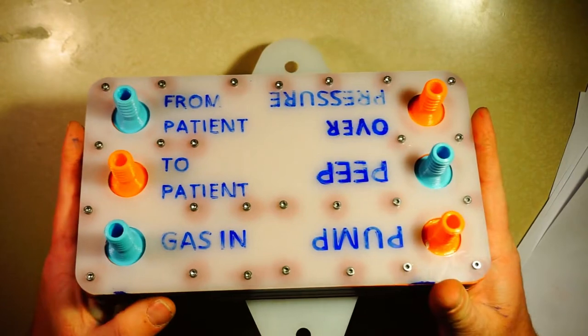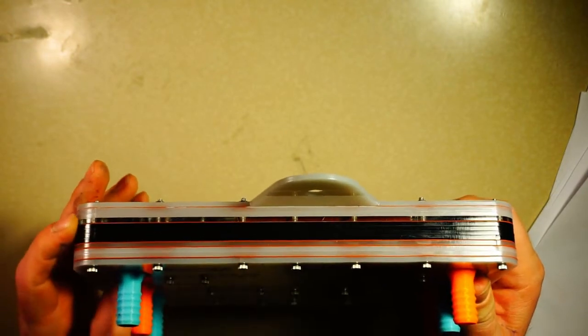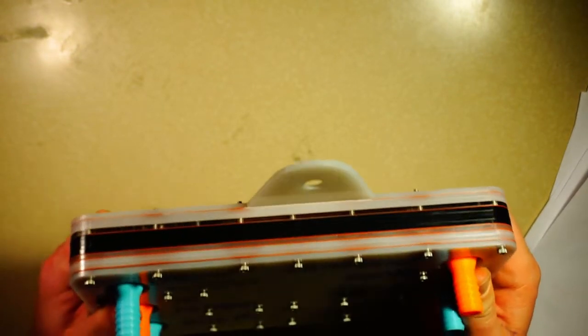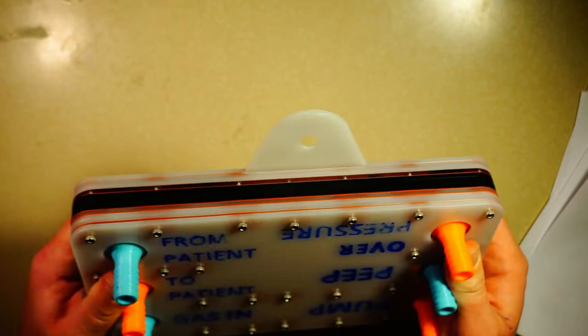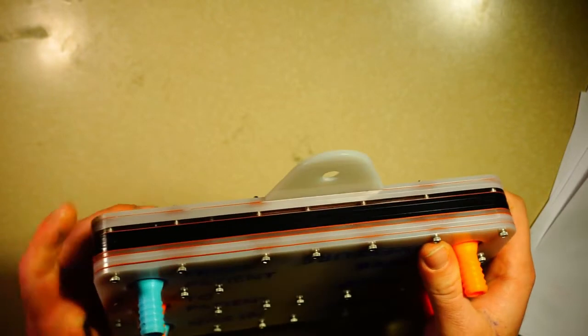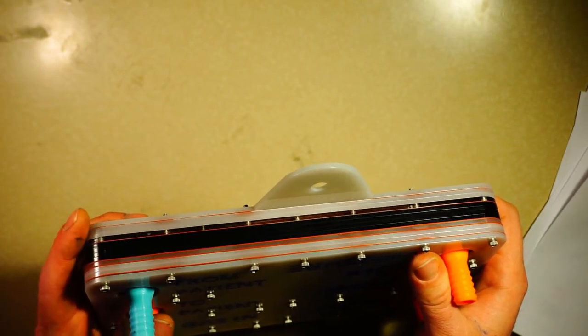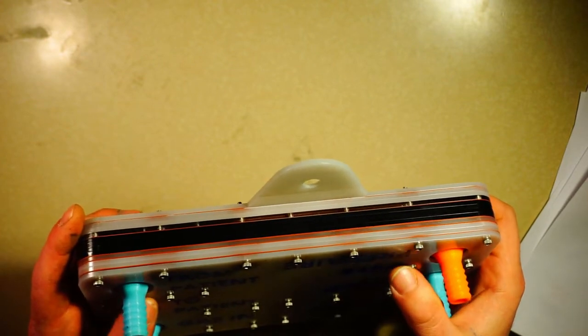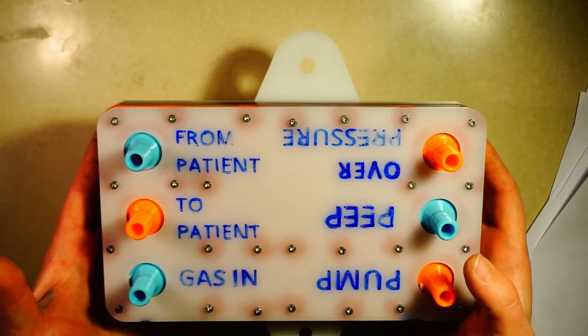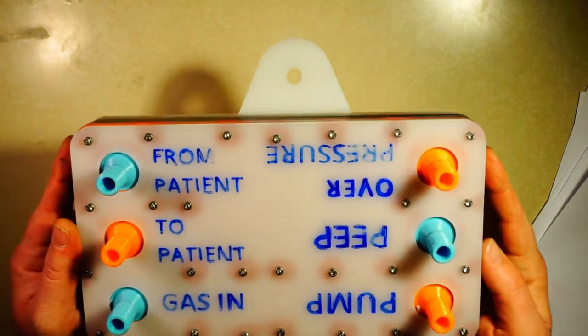Interestingly enough, we had planned to bond some of these acrylic layers together that do not have a seal between them, but we found that it seals perfectly just with a little bit of pressure and tension from these screws, and some of these layers don't need a gasket between them. Some of the layers certainly do, because those form gaskets and membranes and check valves within the system.